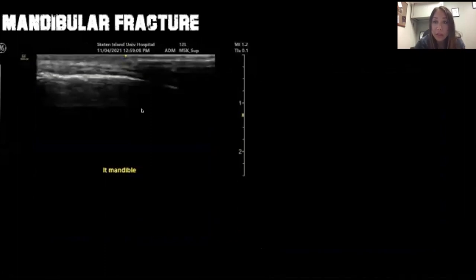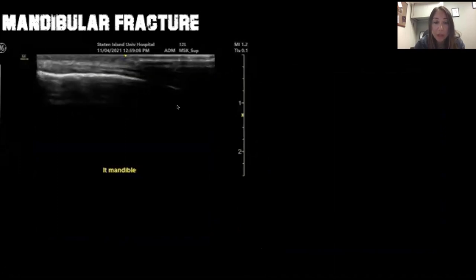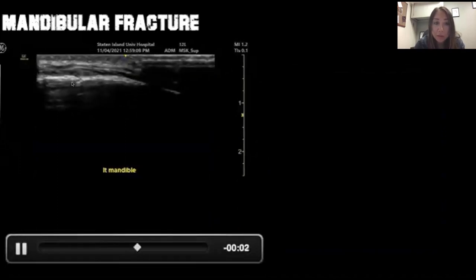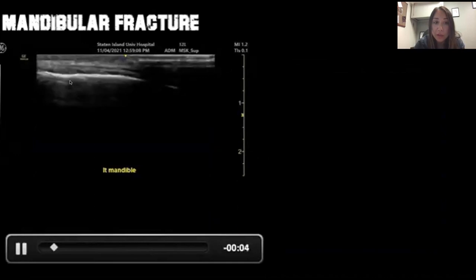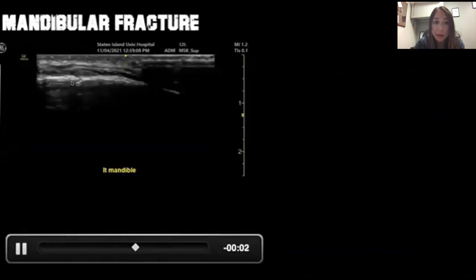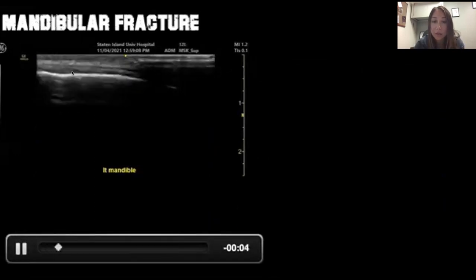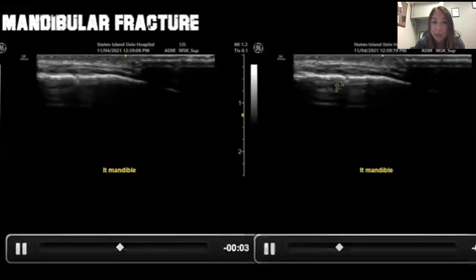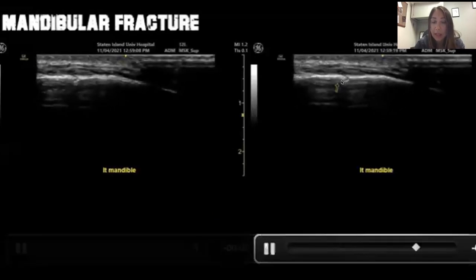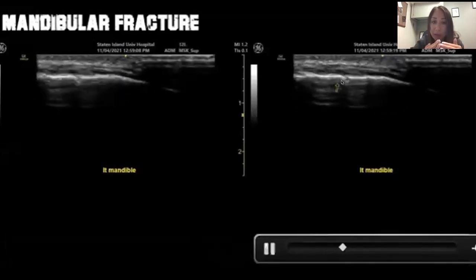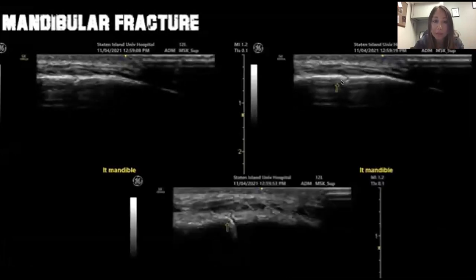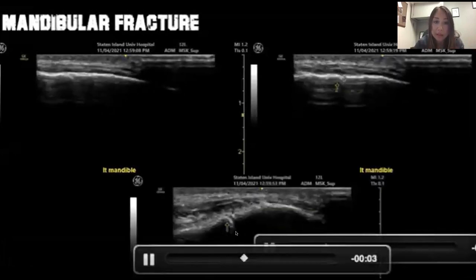We can use ultrasound to diagnose mandibular fractures. Just like any other MSK bone ultrasound, bones are hyperechoic and you're looking for a little break. Right there you can see a little fracture in the mandible. In another example with the arrow, you can see the bone is no longer continuous — that little break confirms the fracture.